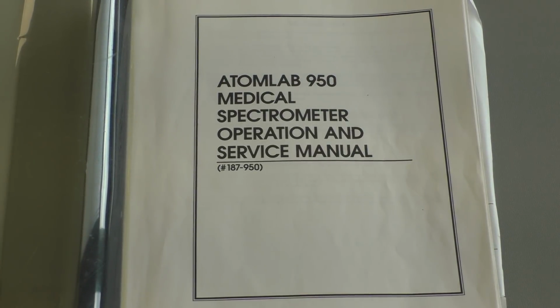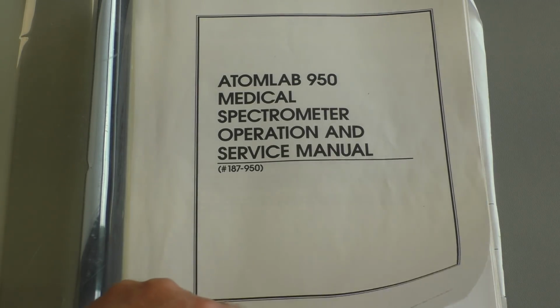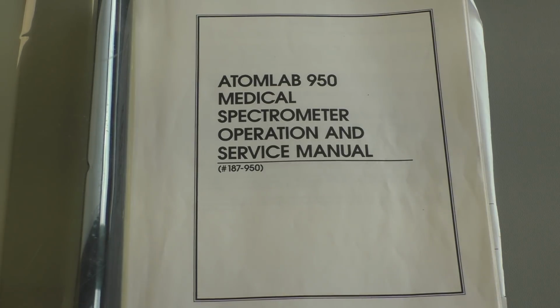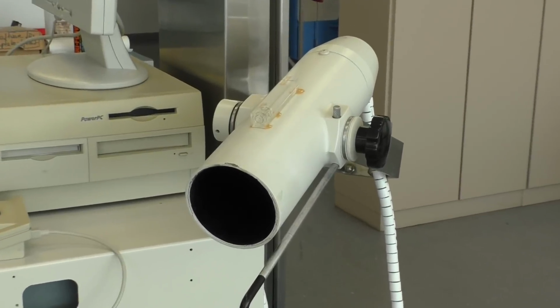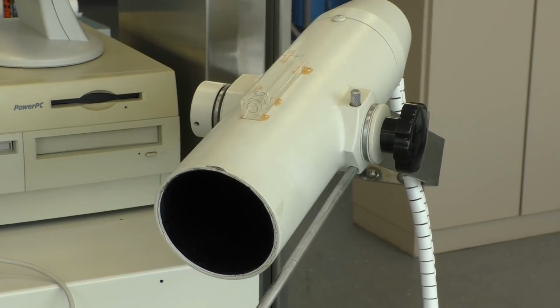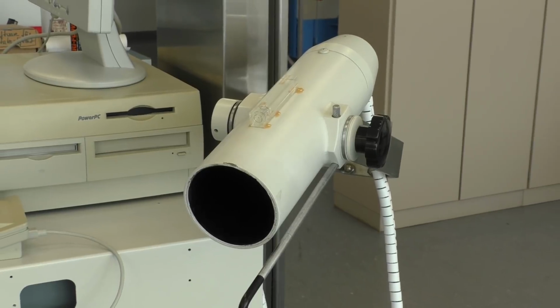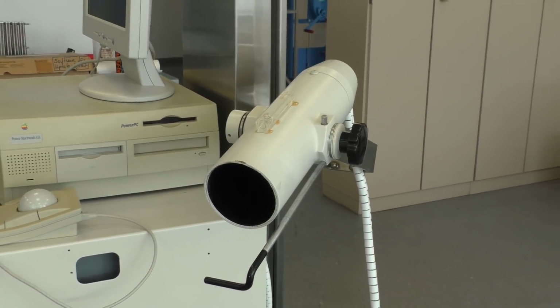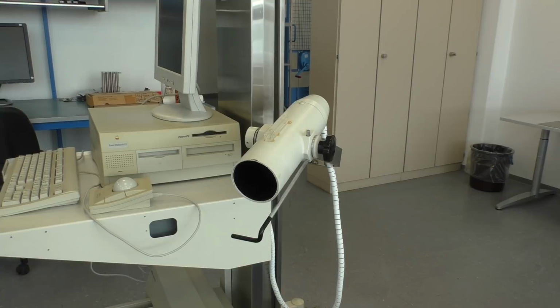Just from the look of it, it must be something medical, and here is the user guide. It's an Atomlab 950 medical spectrometer from Biodex Medical. The medical spectrometer is more or less this tube here, together with a small box that is under the computer table here, and it analyzes gamma radiation that comes from patients that have been treated with some nuclear medicine stuff, for example cancer treatment and all kinds of these things.